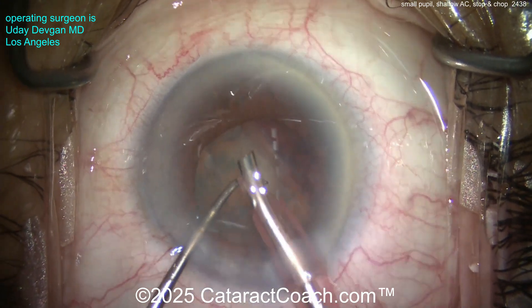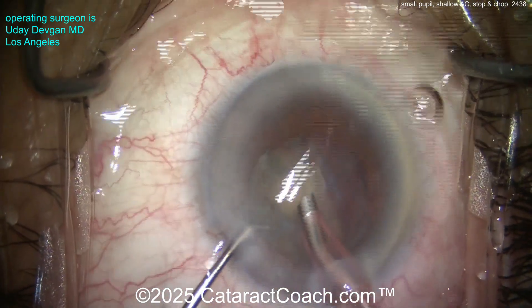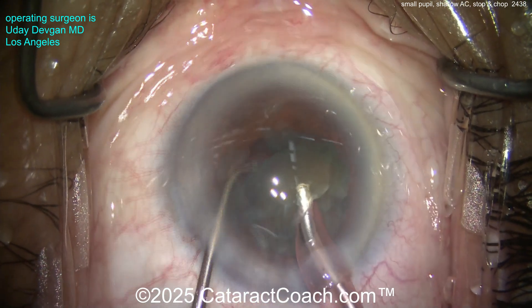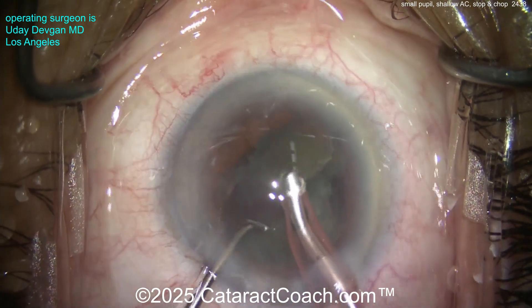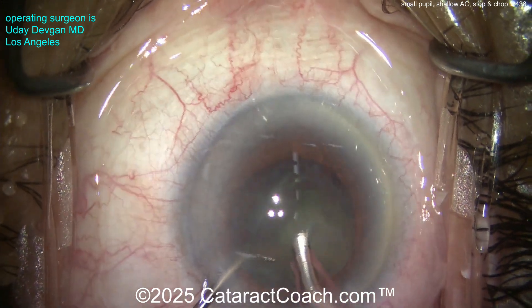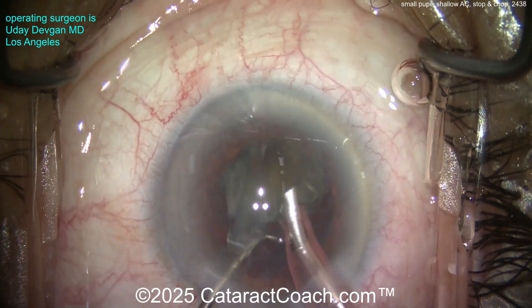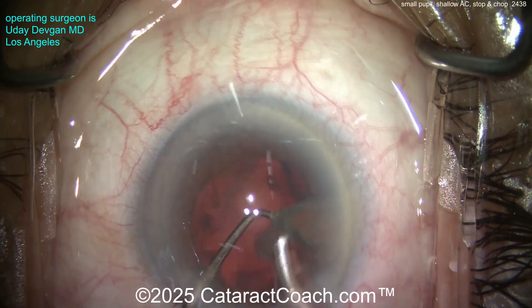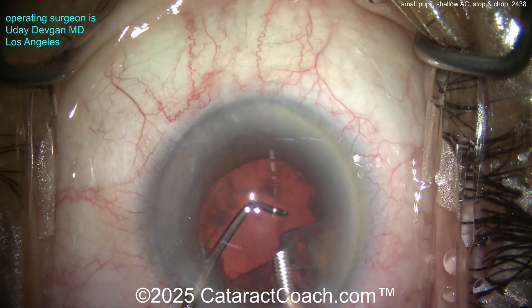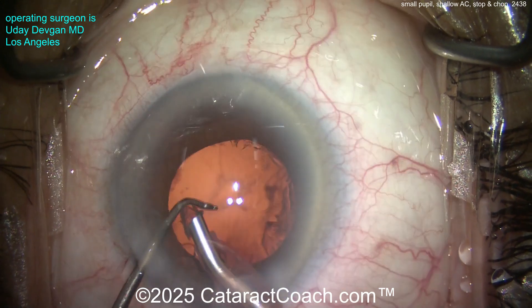The pupil is already coming down a little bit. You might ask why I didn't use iris hooks or a pupil expander — you can use whatever you want, but in this case I felt the path of best safety and least invasion was to do this. Here comes a little chop — just chop a tiny piece off so I can aspirate it down. I'm happy to use the phaco probe with the pupil at about four and a half to five millimeters. I'll keep the back smooth end of the chopper in that safe position toward the posterior capsule.